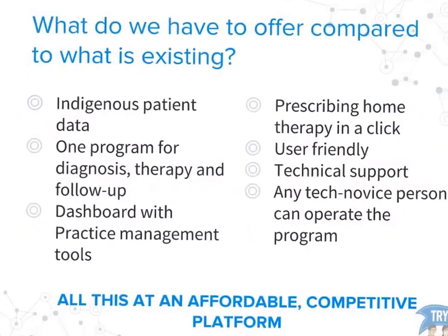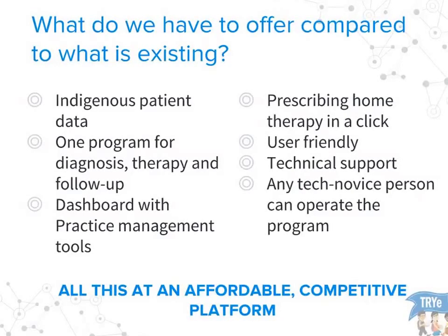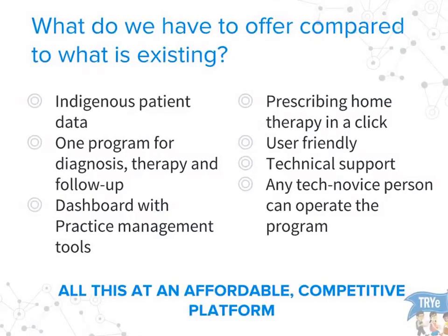So just to emphasize, what do we have to offer? We have indigenous patient data. At one click, you can diagnose, you can provide in-office therapy, you can provide home therapy, you can follow up the patient. You have a very attractive dashboard with all practice management tools, and then you can prescribe home therapy in one click. Very user-friendly, technical support is given 24/7, and any tech-novice person can operate the program. All this at an affordable, competitive platform.